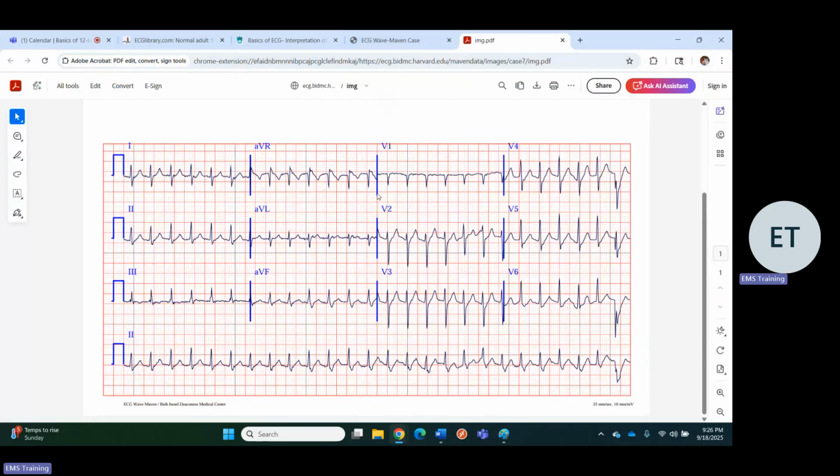So it could definitely be AFib, but the morphology's changed. So there's definitely something different going on in one part of the EKG compared to the next. Additionally, it does look like there's notching here, and then that looks like an accessory pathway, doesn't it? That looks like a delta wave, but it's notched here. So this seems like it's intermittent.